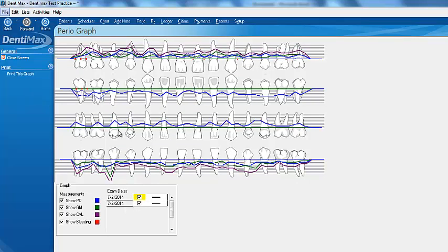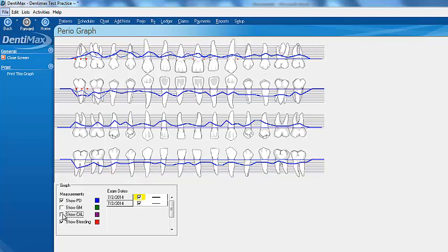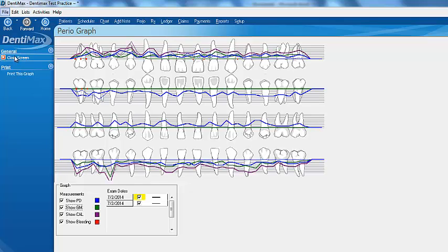You can view multiple exams graphed on your screen at the same time, though you might want to declutter it. Here we're comparing just probing depth side by side — a darker line and a lighter one. Normally you'd have different dates, so you can see improvements with your perio measurements over time. This is a great patient education tool for comparing perio measurements from different dates.